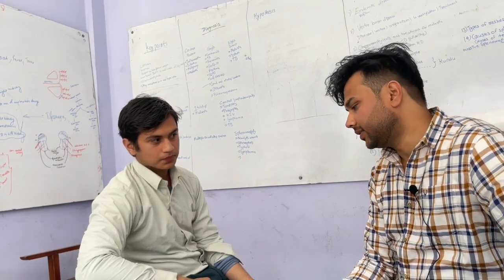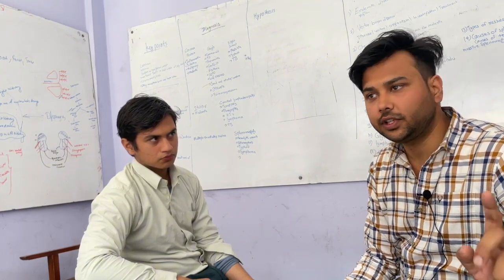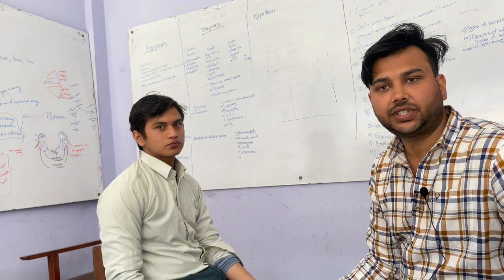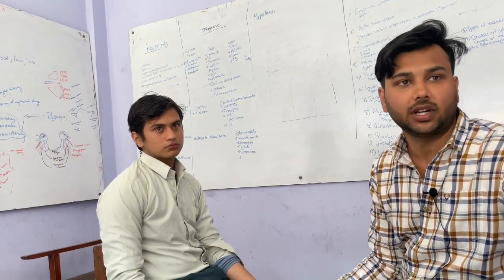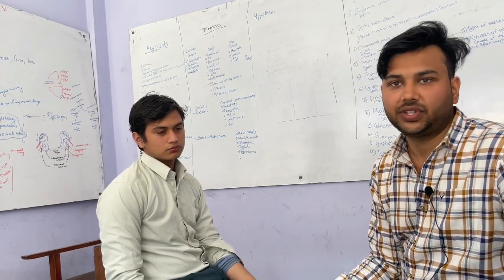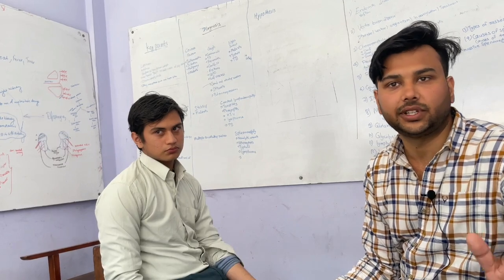Okay. So for checking blood pressure, there are a few prerequisites. You cannot check the blood pressure of any patient anywhere. There are a few prerequisites that must be fulfilled before checking blood pressure. The first and foremost important thing is the patient should be well rested. If the patient came hurriedly to your clinic and you wasted no time in taking blood pressure, it will of course be higher, and that will be an erroneous or false blood pressure reading. So whenever a patient comes, make sure the patient has ideally at least 30 minutes, and if you are in a hurry, at least 5 to 10 minutes of rest.